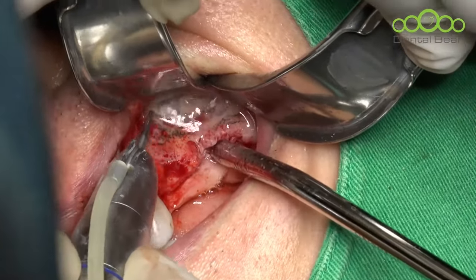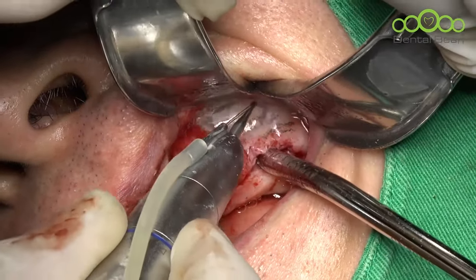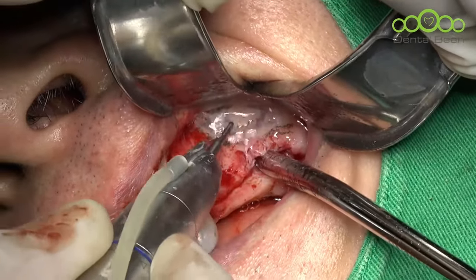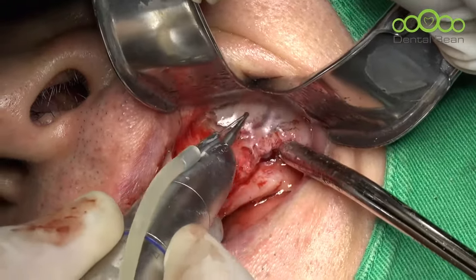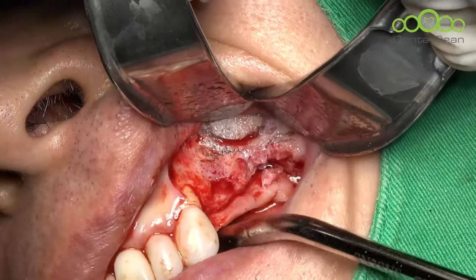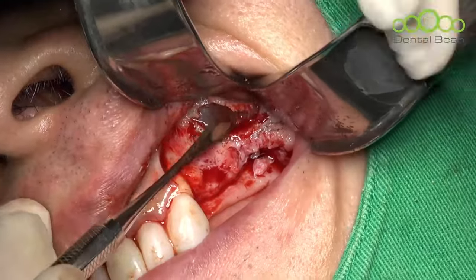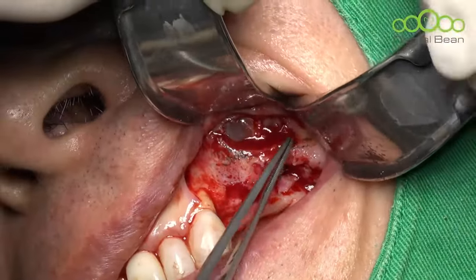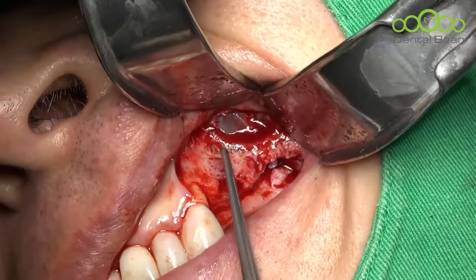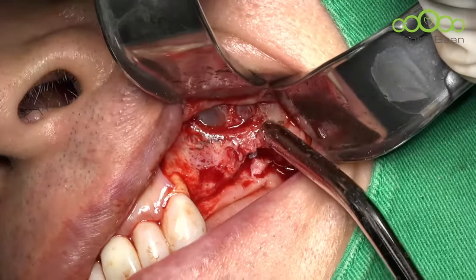Cannot retract flap well in this patient. The window looks slightly too small. Here is the septum. Let's remove the window. Okay, like this. I like to remove the window. The septum is there. I expect the septum here, but the position is slightly distal. As a result, the distal hole looks not well exposed.